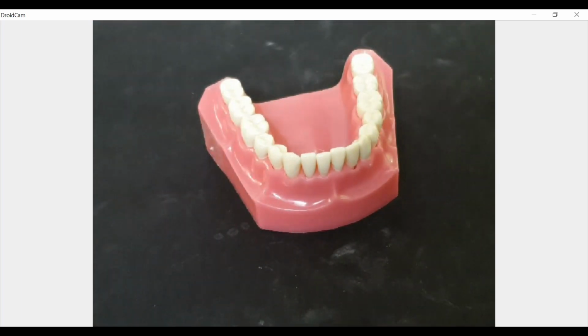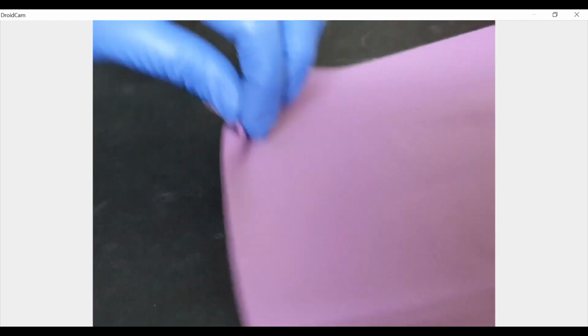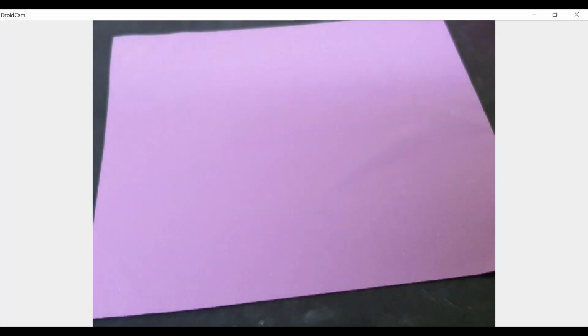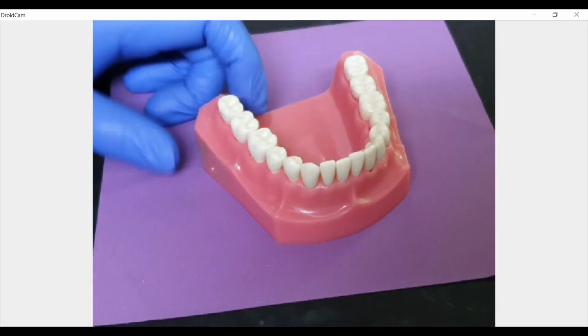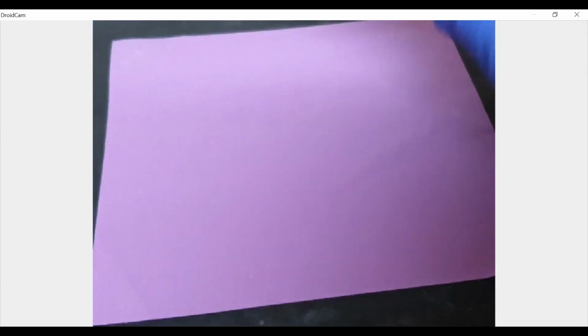Again, now we will take another rubber dam sheet. Yeah, so we have another one. Again, we have to follow the same steps. Now, because it's multi-teeth isolation, if you have tight contacts while you're doing this, you are going to do pre-wedging. So you will start placing wedges into all those areas where you're going to place your rubber dam sheet. So that's one thing.